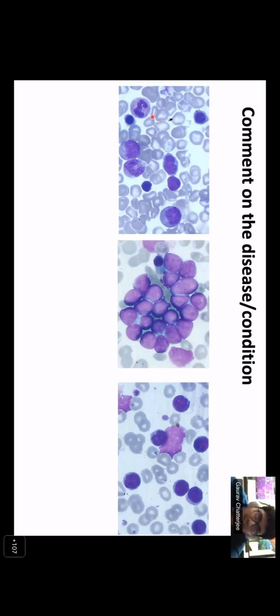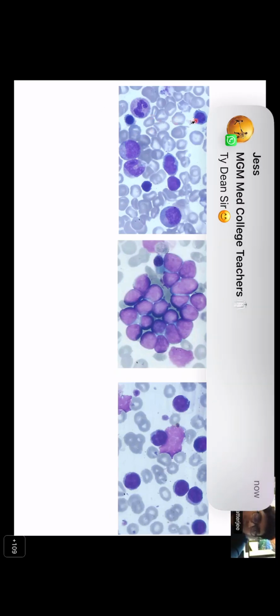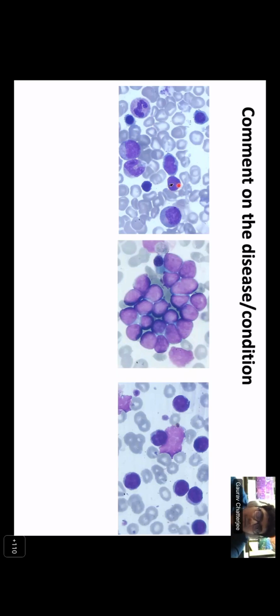Sir, normoblast. Right. So now I think Sonam said erythroid, right? So can you see the erythroids now, Sonam? They look completely different, no? Their chromatin is different. They are much more centrally placed. So these are erythroid cells. This cell, like Yogita said, is probably a lymphoblast.